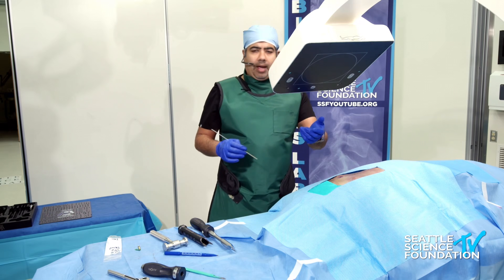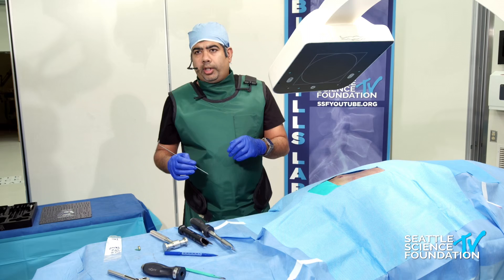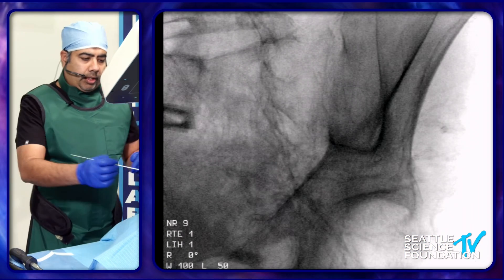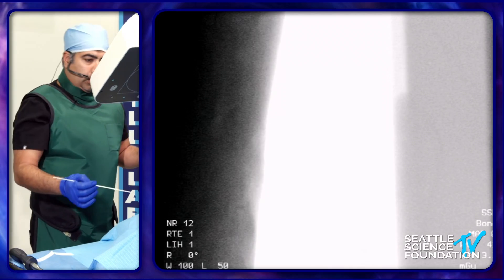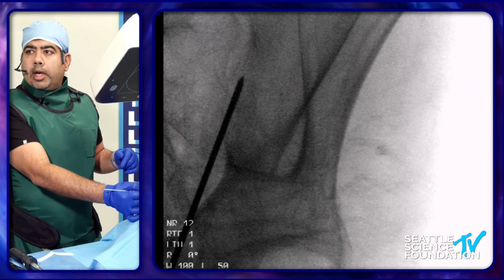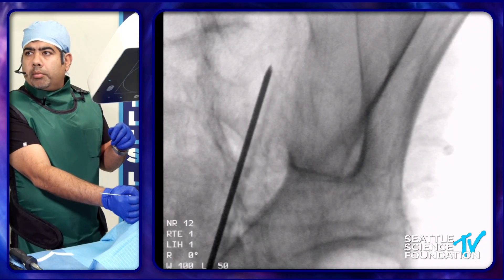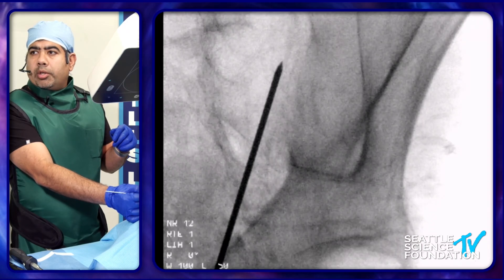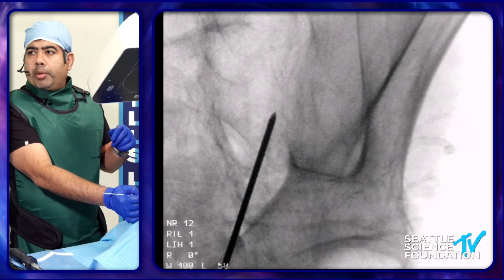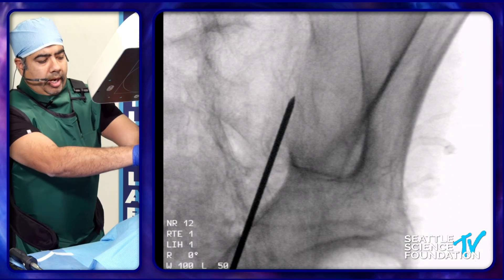For the device, I'm doing the right side here. I've got about 20 to 25 degrees of contralateral oblique. You can see where the PSIS is going, and then you go right below the PSIS and you can put your Steinman pin in there.